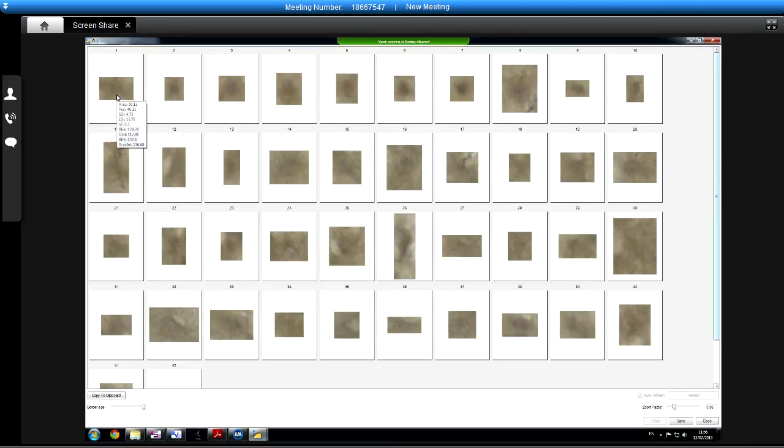So it's just under 40, about 40. False? Yeah. 63. Would that be a tree, do you think? I wouldn't count it. No. Okay. 40. Well, that's some of these along here.